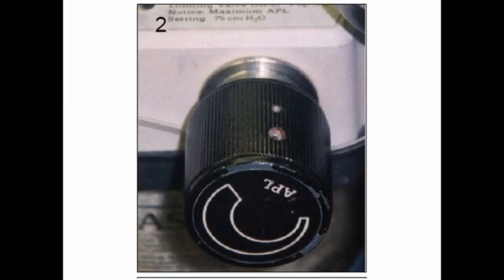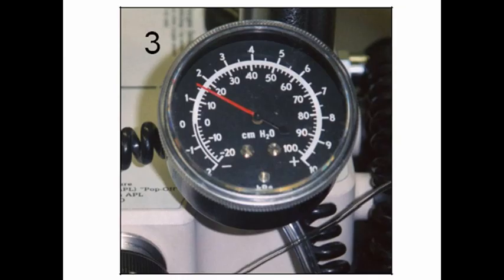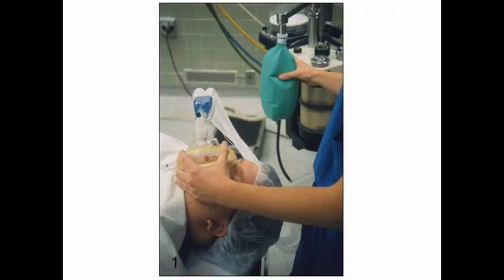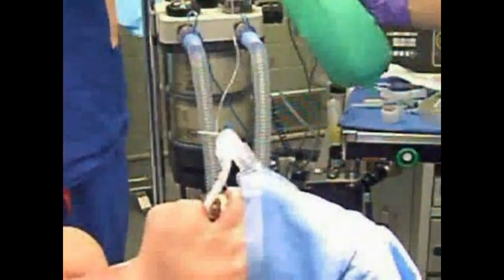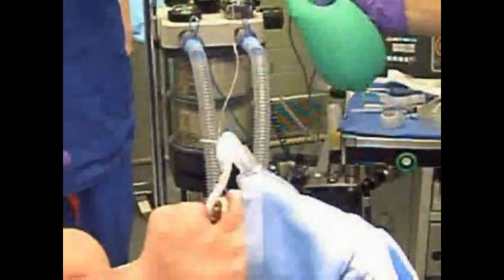The endotracheal tube is then connected to the breathing circuit, and the adjustable pressure release valve is adjusted to a pressure of about 20 centimetres of water, and the reservoir bag is squeezed while looking for bilateral symmetrical chest excursion. The reservoir bag is squeezed a couple more times while the lungs are auscultated, high in the left axilla, then high in the right axilla, because these positions will allow you to listen to all lobes of the lung. We want to confirm bilateral symmetrical breath sounds.